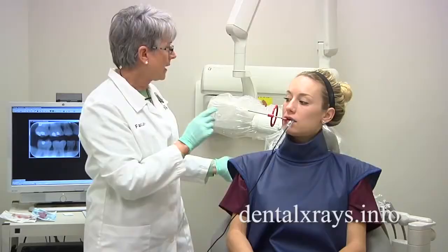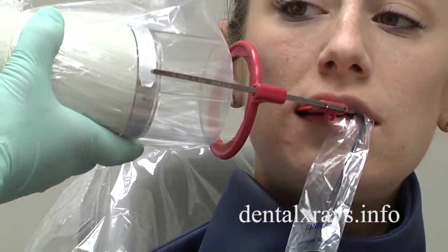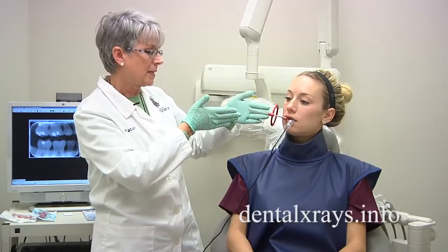However, you cannot take the x-ray just like this. If I would take this while it's twisted in the mouth, it's a paralleling technique and the horizontal angle is going to be coming like this, and you're going to have overlap.